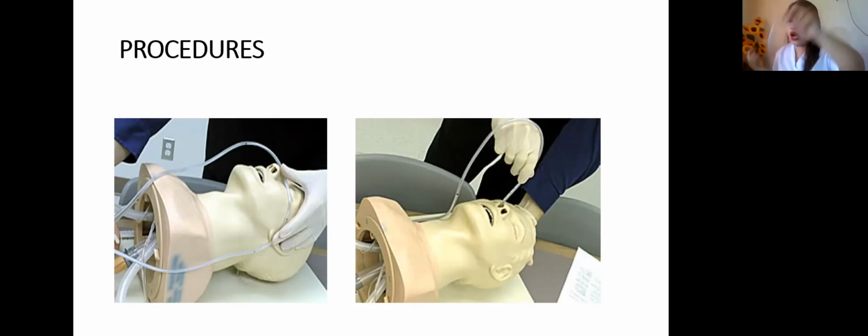For example, you will insert already the tube. In inserting the tube, you can ask the patient to have a sip of water. While you are inserting, the patient is in an upright position, just take it slowly and ask the patient to have a sip of water. But before that, you need to put a lubricant gel. So what is the simple step in using this one? Ask someone to put the lubricant gel here to be more comfortable for you.